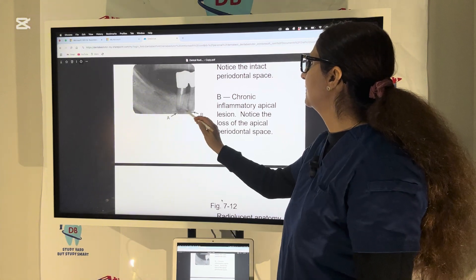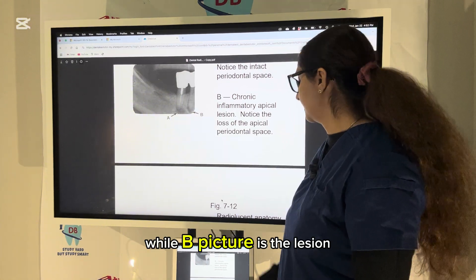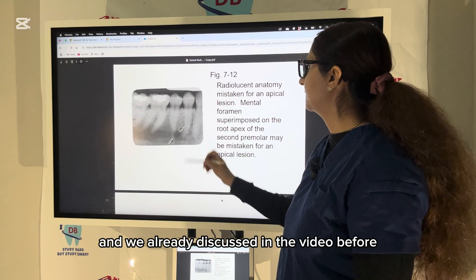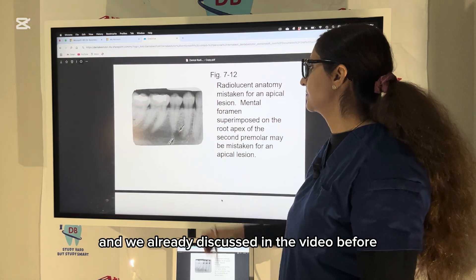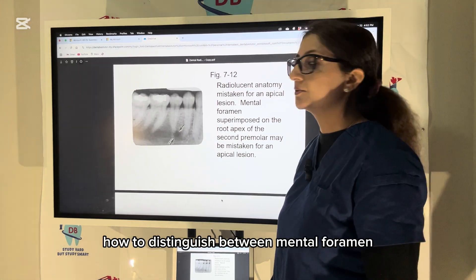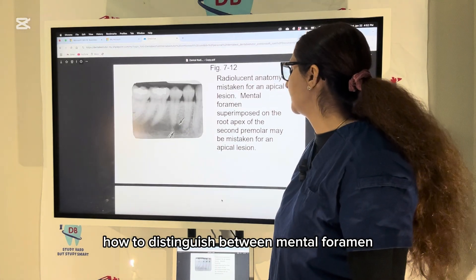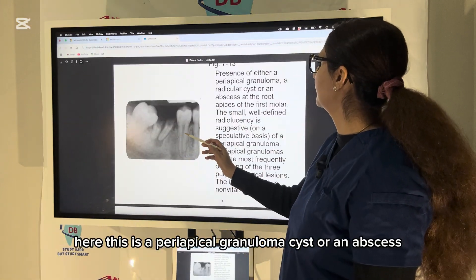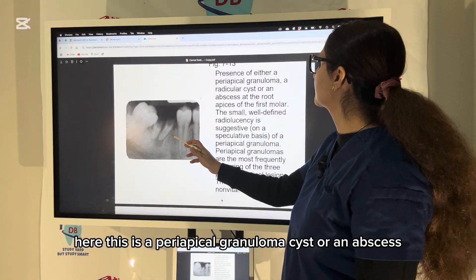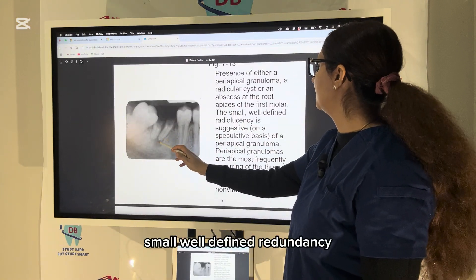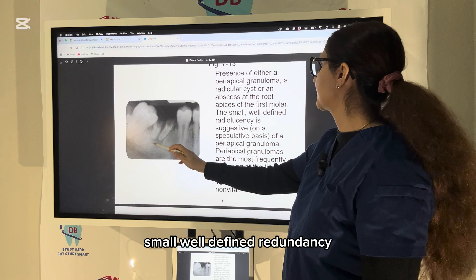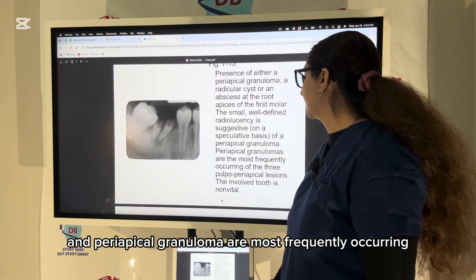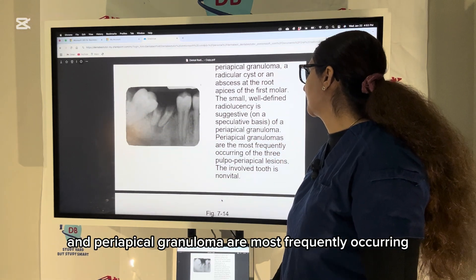Picture A shows the mental foramen while picture B shows a lesion. This picture is also a mental foramen, and we already discussed in the previous video how to distinguish between the mental foramen and periapical pathology. This is a periapical granuloma, cyst, or abscess. A small, well-defined radiolucency is suggestive of periapical granuloma, which is the most frequently occurring condition in pulp-periodontal disease.